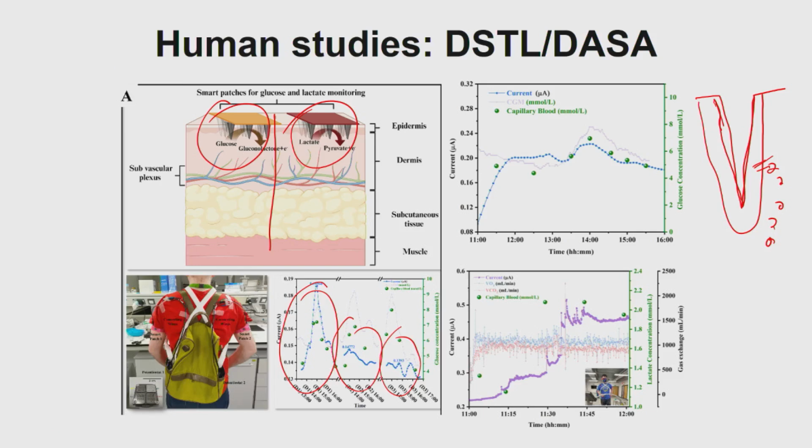Okay, so this is day 1, day 2 and day 3. This is some example of some lactate measurements that were done. As you can see, they've got a super fit athlete on the treadmill doing the exercise, and then you're measuring your lactate in response to the exercise. Well, I'm not super fit, it's myself on the treadmill there.